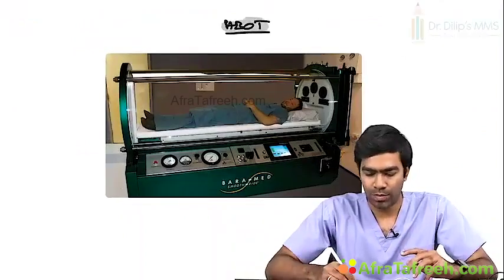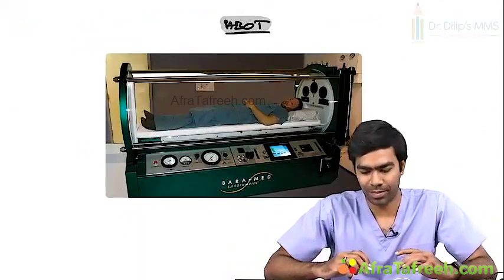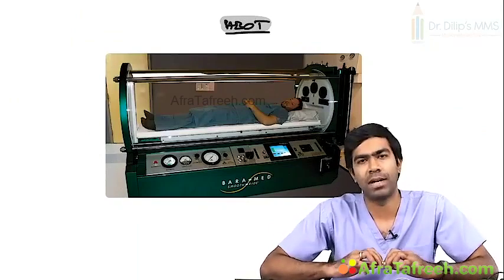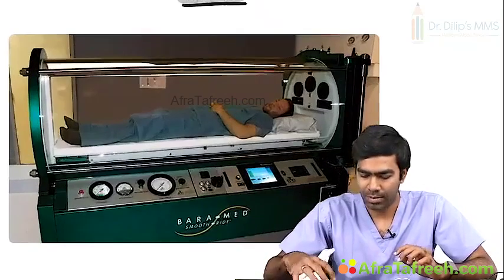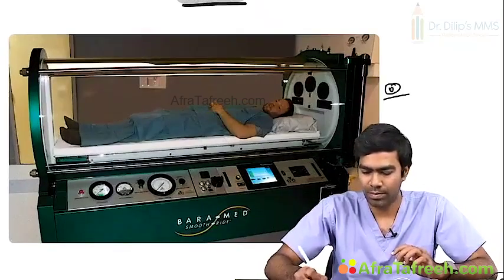Then we are moving on to some of the special devices, that is hyperbaric oxygen therapy, HBOT. This is a hyperbaric chamber. This could be a potential question in the exam. They may show a chamber like this and ask you what this is. This is a hyperbaric chamber.